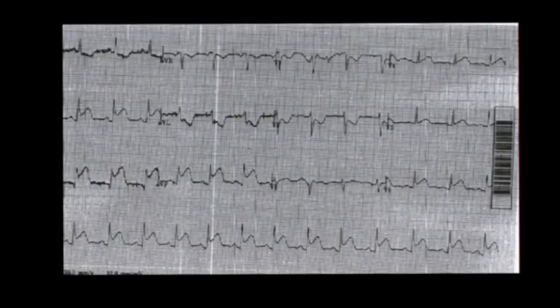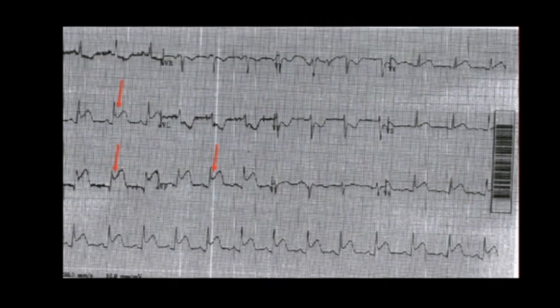So, what will an inferior wall MI with a right ventricular MI look like on an EKG? We will still see the ST elevations in leads 2, 3, and AVF representing the inferior wall MI. But what about the right ventricular MI? How will that show up on EKG?